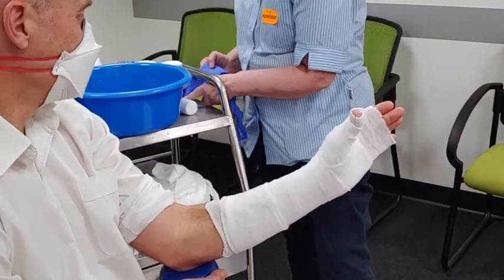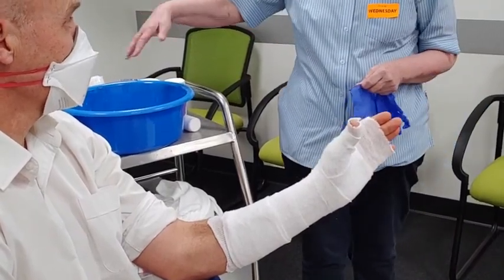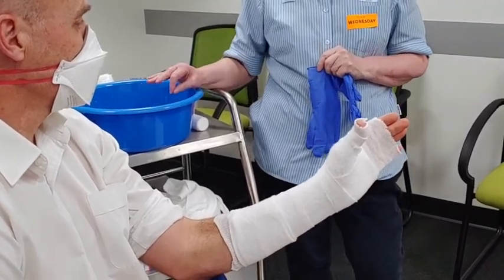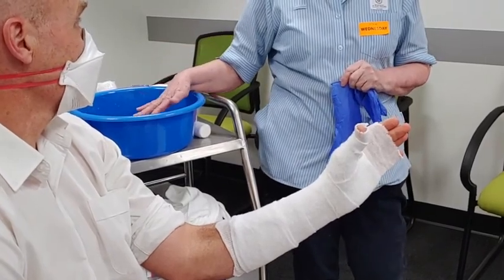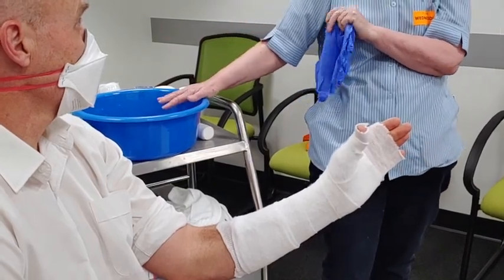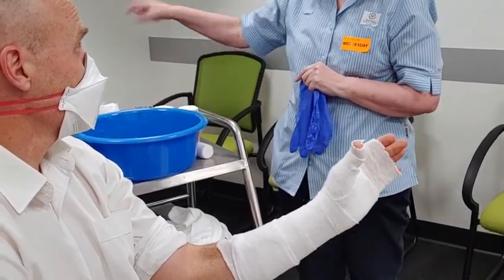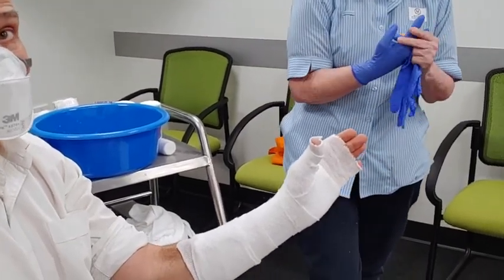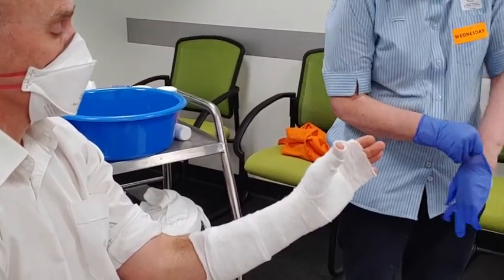Water should be out of the plaster trap. If you're in an area that doesn't have a plaster trap, use paper toweling inside the bowl — four layers. At the end, pull that up and scoop it in the bin. There shouldn't be hardly any plaster in there if you're using plaster of Paris, and none at all for synthetic. If you've only got fiberglass, you don't need the paper lining.